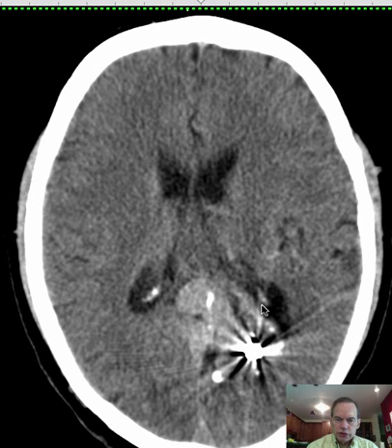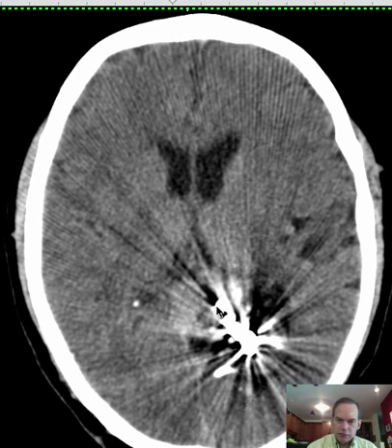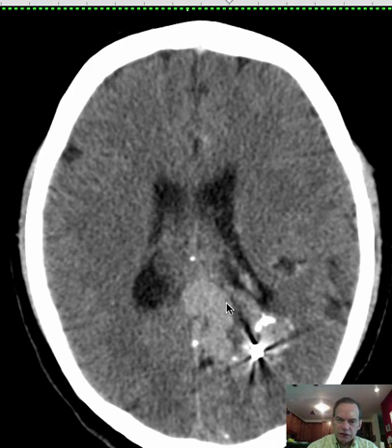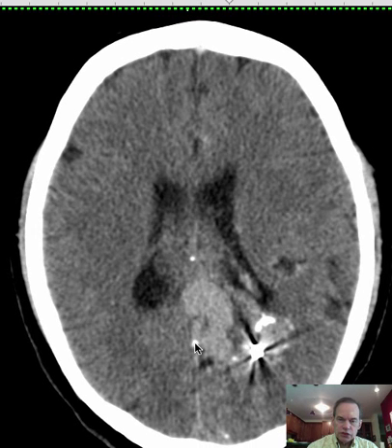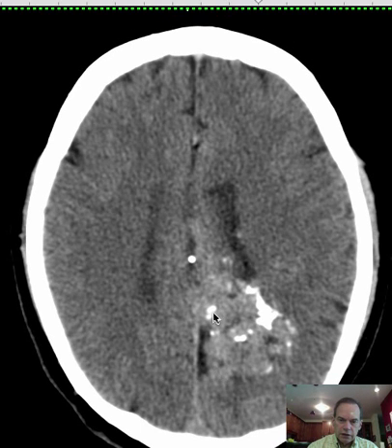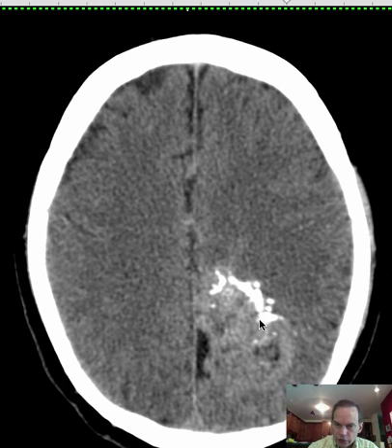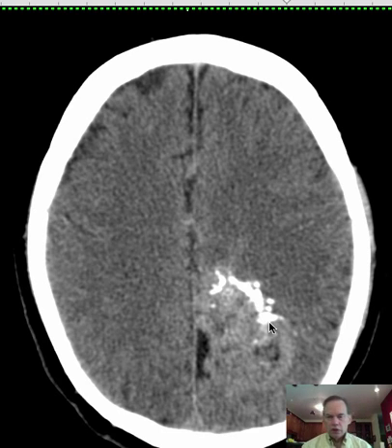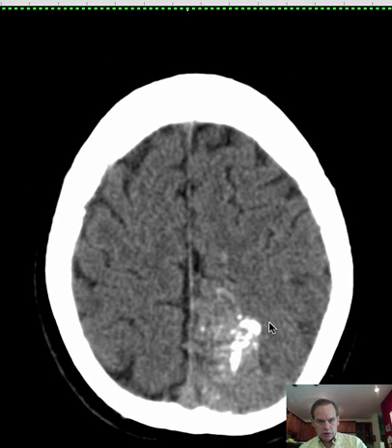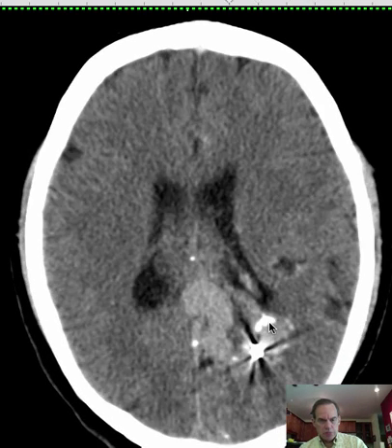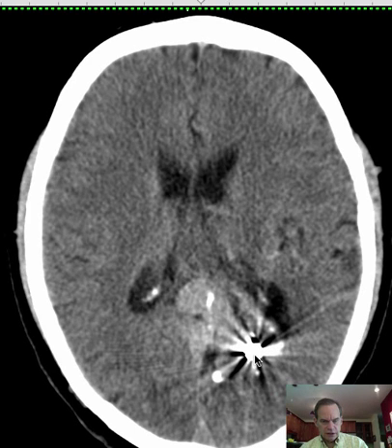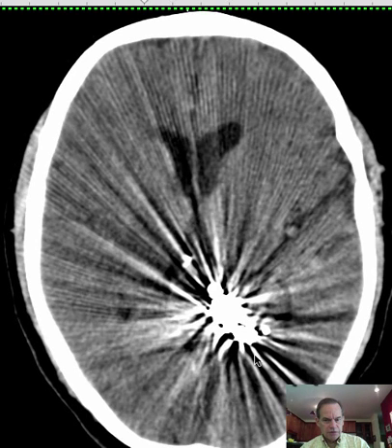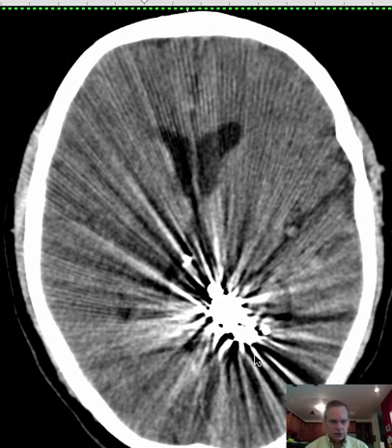There are some associated calcifications — remember, there's no IV contrast here. Here are calcifications of the falx. Some of the more dense structures are embolic material that has been used to embolize this structure.